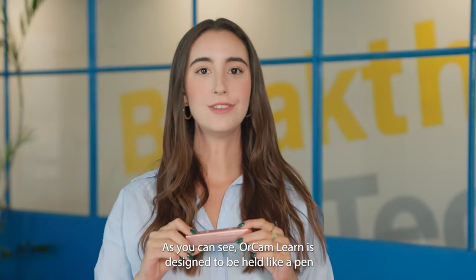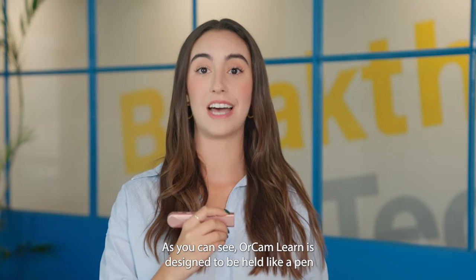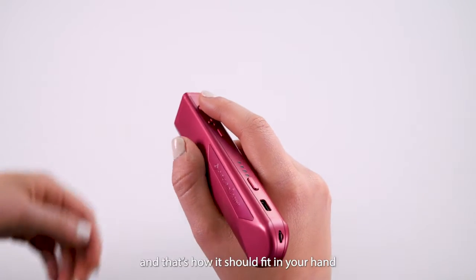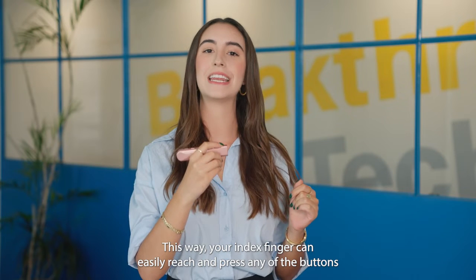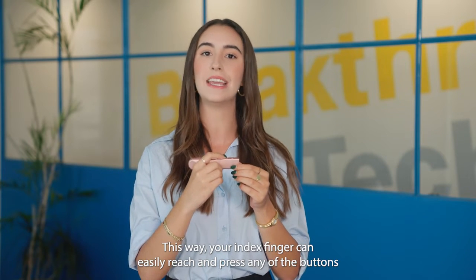Let's get started. As you can see, OrCam Learn is designed to be held like a pen and that's how it should fit in your hand. This way, your index finger can easily reach and press any of the buttons.